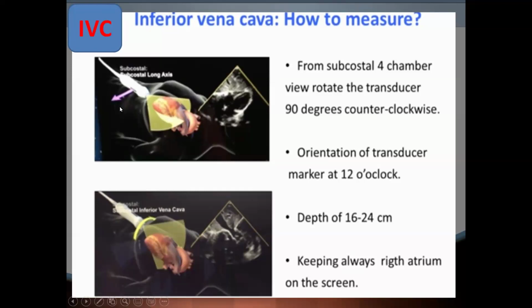After that, you rotate your probe anti-clockwise 90 degrees, moving the pointer from 3 o'clock to 12 o'clock.